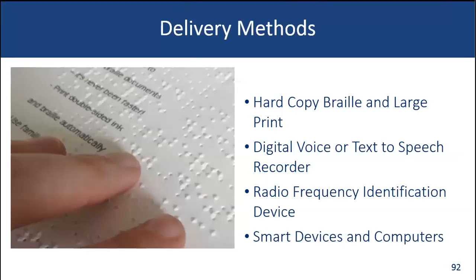Another delivery method could be digital voice or text-to-speech recorder. This would be something like a small electronic device that a pharmacist affixes to the prescription drug container. When activated by pushing a button on the device, the patient hears the information printed on the prescription drug container label.